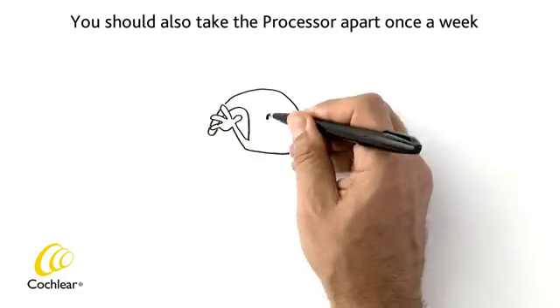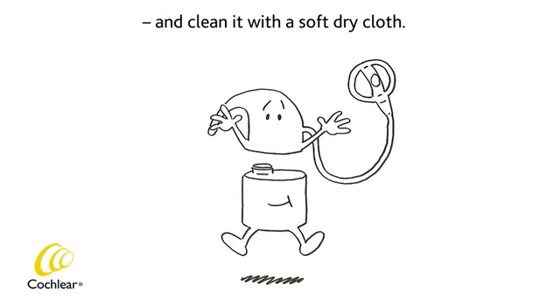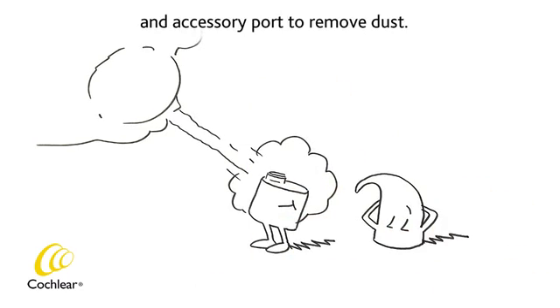You should also take the processor apart once a week, leaving the e-hook in place, and clean it with a soft dry cloth. Gently tap or blow on the battery contacts and accessory port to remove dust.